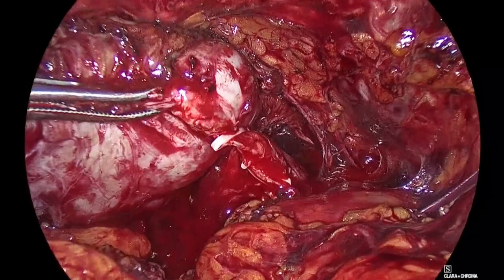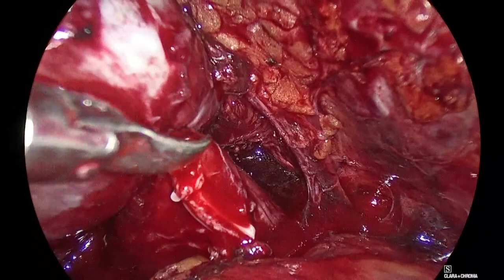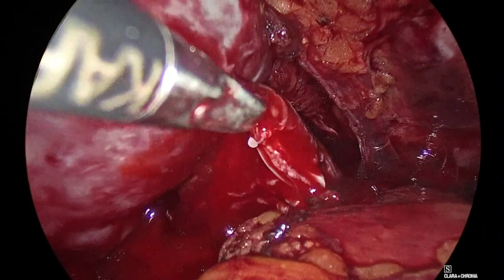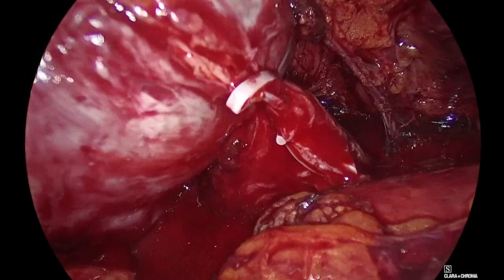Scissors? You see that artery pulsating there? Let me see. What would you do now? Here, would you buzz it or would you suture it? Look, it stops just by touching the whole thing. Or would you put another clip on it? Alan? I would place another clip. You place another clip. It's a non-nerve sparing. Clip. Or bipolar. Clip.